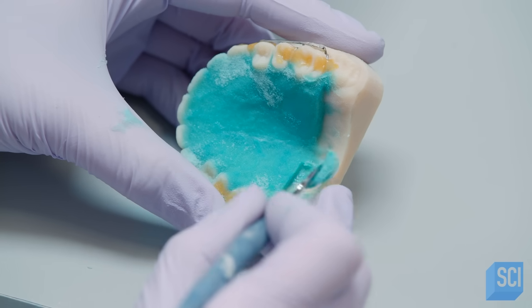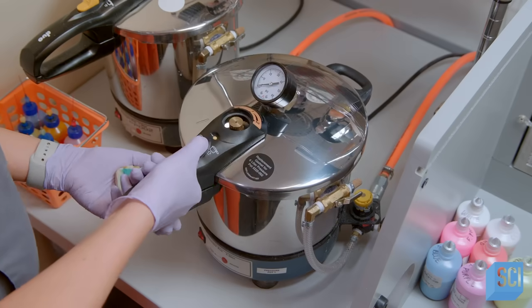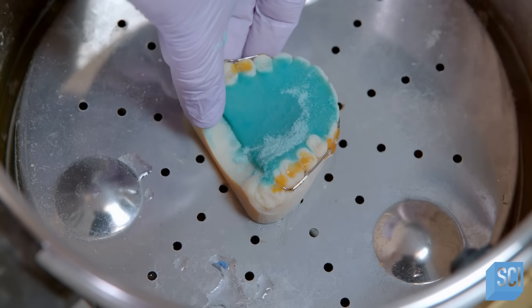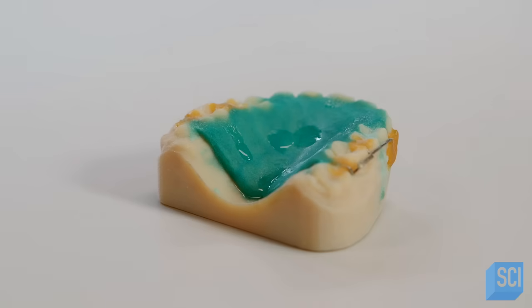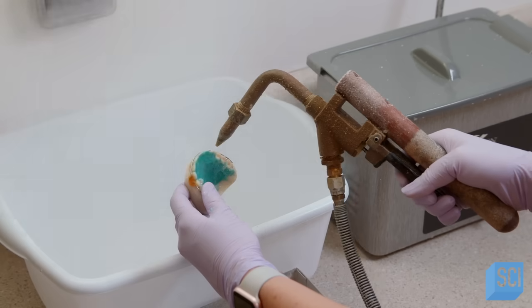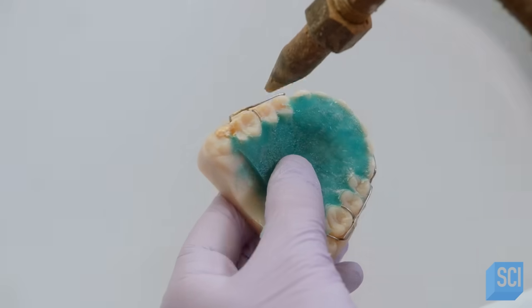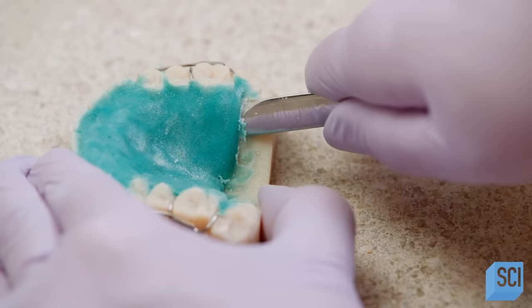The excess acrylic is trimmed off with a knife. Then the model is placed into a pressure cooker for 10 minutes. The pressure removes air bubbles in the acrylic, while the heat speeds up the curing. When the acrylic is ready, the technician uses a steam gun to melt the wax holding the wire to the model. She removes the fully formed retainer off the model.